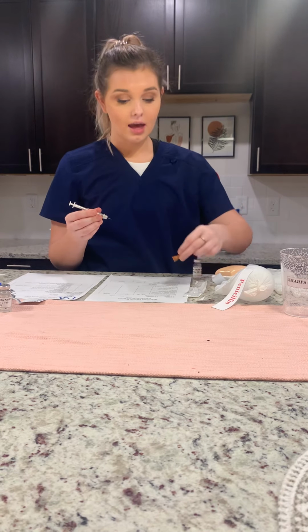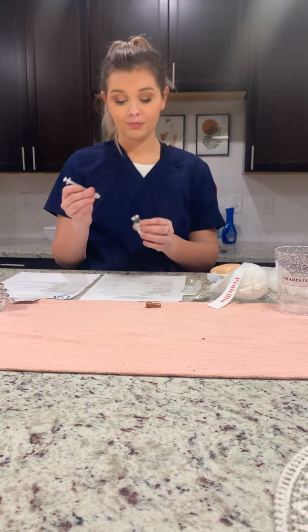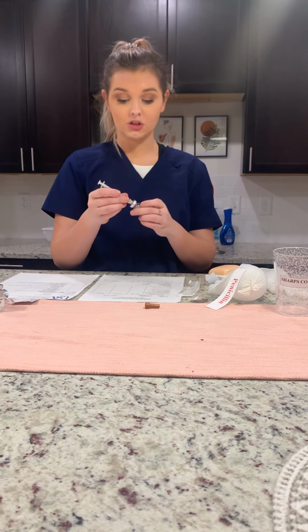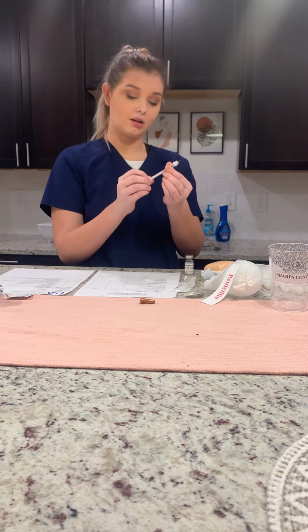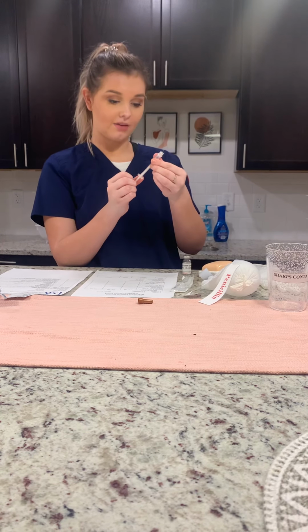This heparin is labeled at 10,000 units per milliliter, and since the order is for 5,000 units, I will be giving him half of a milliliter. And the medication is not expired. It does not expire until 12/5/2025.